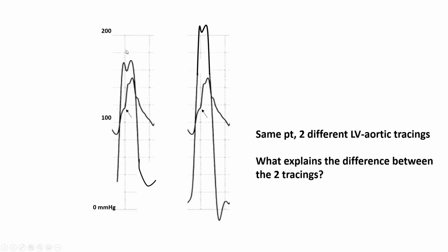And here is a hint to you. When you do this recording and you see a nice dicrotic notch, that's a hint to you that maybe there is an error here. Could it be an error in zeroing? Could it be an error in damping? Or could it be that error that I'm going to talk about right now? So that's why analyzing morphology is important, because it's a hint for you to do more, not stop at the shallow assessment of numbers. Okay.